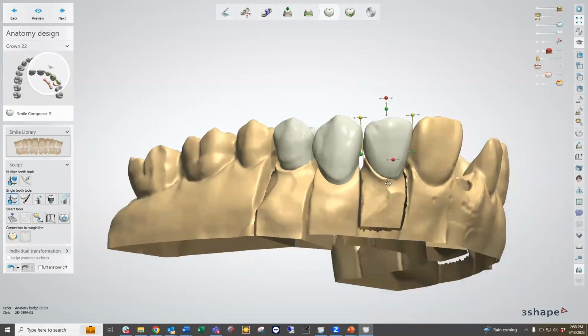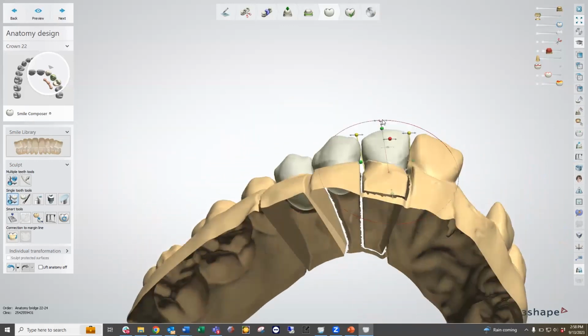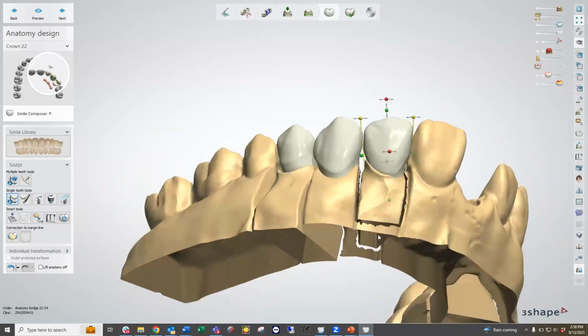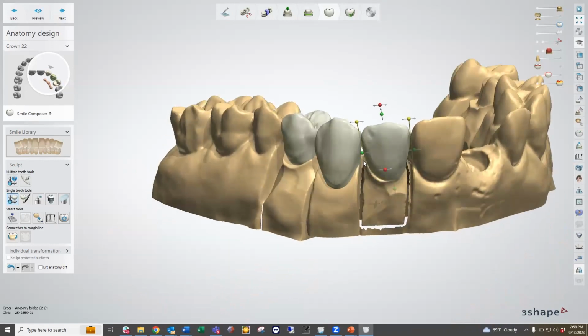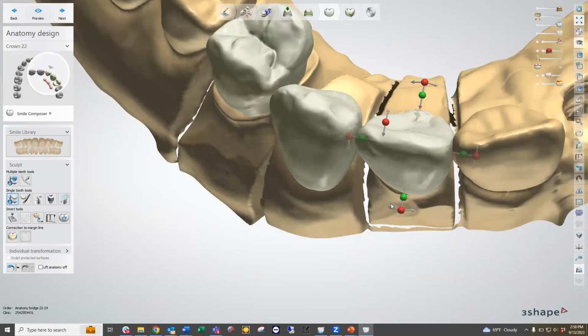Drag that one down. It doesn't matter how far we drag it down, it can come through the model, because we do have that option to connect to the margin line afterwards. So I'm always just kind of aware of that as a function that we have available to us.